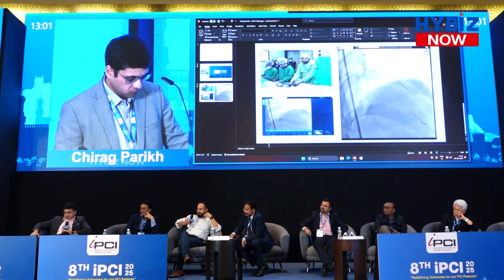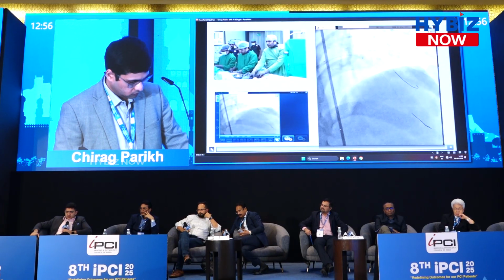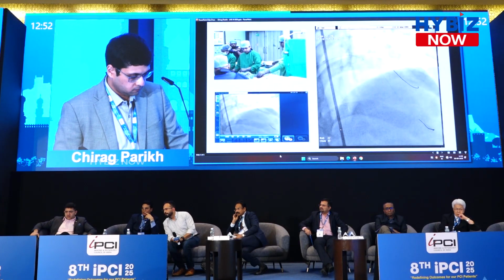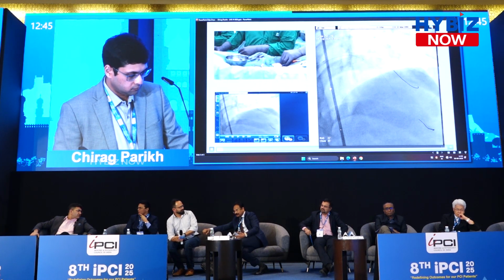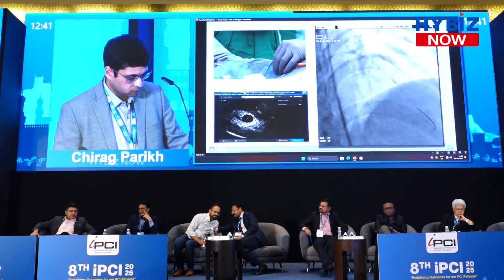Next, the Syncvision system. Syncvision system works best with the Eagle Eye catheter. It's a 20 megahertz catheter, but what I really like about this catheter is that it's a plug-and-play system. We'll be performing a pullback under continuous fluoroscopic guidance.